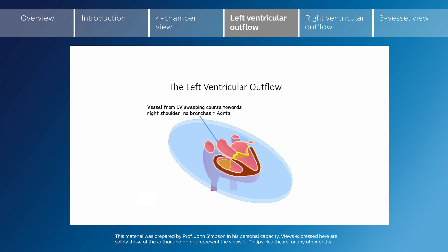We identify the aorta by the fact that it does not bifurcate to supply the pulmonary arteries. Its only branches are towards the head and neck vessels, with continuation into the aortic arch. Very importantly, there is a line of continuity between the ventricular septum and the anterior wall of the aorta, which is lost in many forms of congenital heart disease, and it is important to confirm this as we scan.